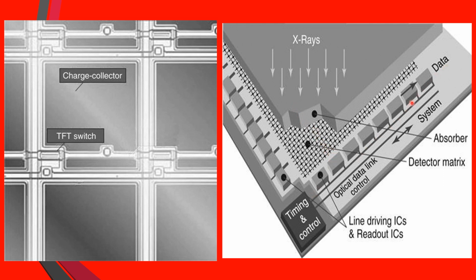And then there's timing controls, there's address buses, there's all kinds of things, and then it gets read out to the system, okay? And you see here that the system can go back and forth, right? So the system, the operator's computer and everything, it's sending data back and forth too, okay? Calibration data and other kinds of things during this process.